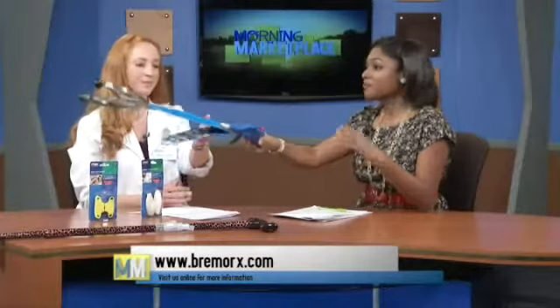Yes, because a lot of the homes here in Richmond, they're older, and when you think about people living into their 90s, some of these older homes are just not set up for that. So things like this, I mean, a grabber for those way high up or low places? Absolutely. So patients can use this from a sitting position. It extends out so they can grab things high to avoid having to use a step stool, or they can also grab low to make sure they're not leaning over and falling over.